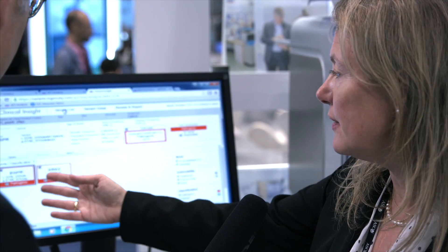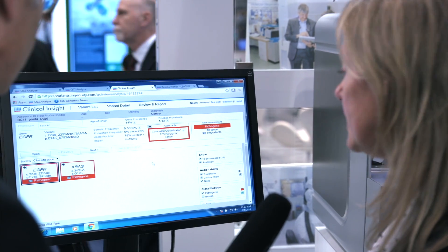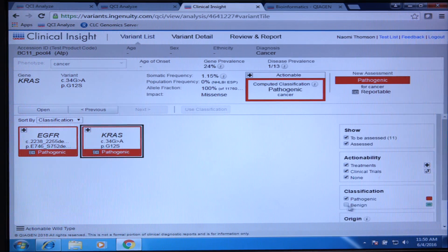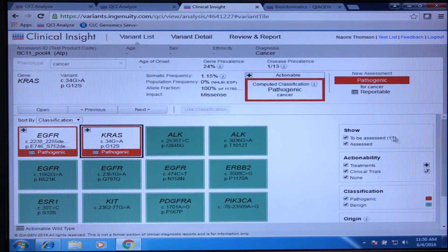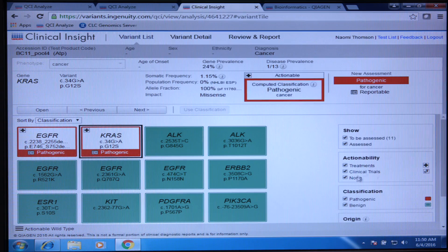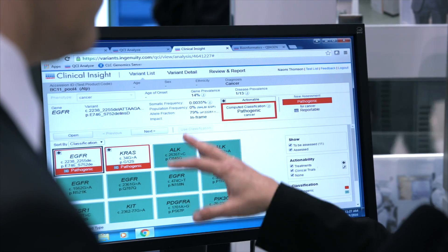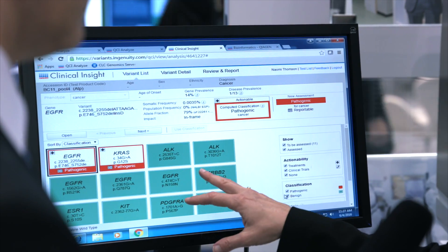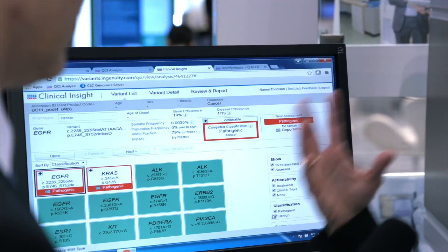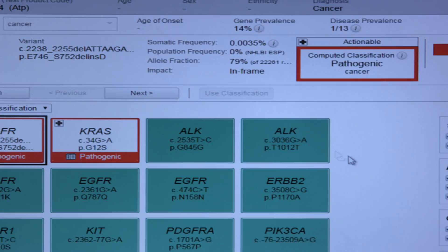So here we have EGFR and KRAS. But in addition to those variants, we also had many benign variants. These are already pre-classified using our computed classification. And if you have additional knowledge from your personal lab's expertise that is outside of our knowledge base, you can also affect that classification.